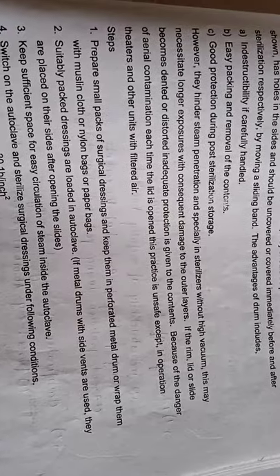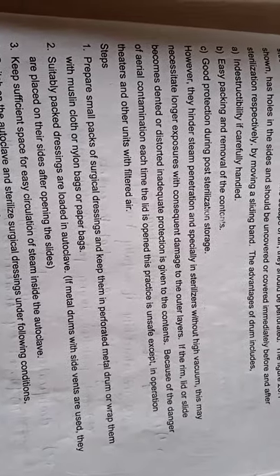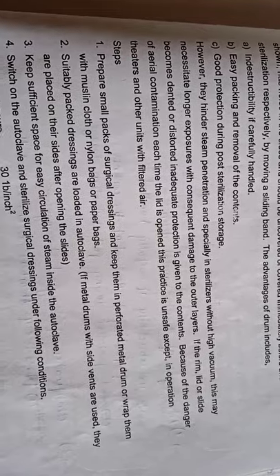Because of the danger of aerial contamination each time the lid is opened, this procedure is unsafe — if we sterilize and the lid is left open or is broken, growth of microorganisms can occur. Therefore, opening the lid is very unsafe. In operation theatres and other units with well-filtered air, the container must be stored in the operation theatre using filtered air in that area.